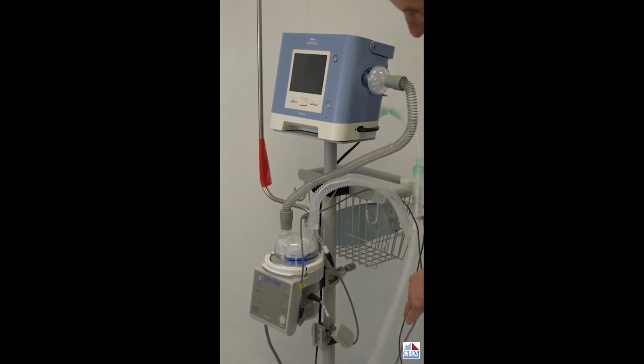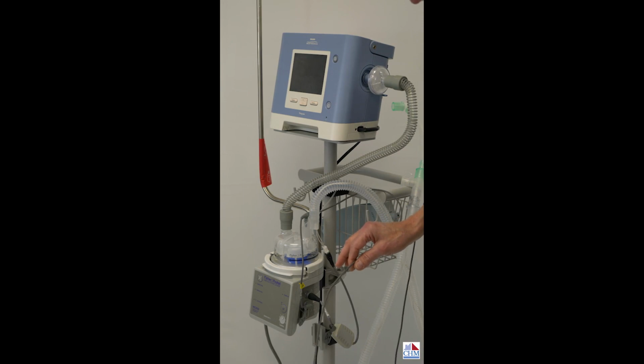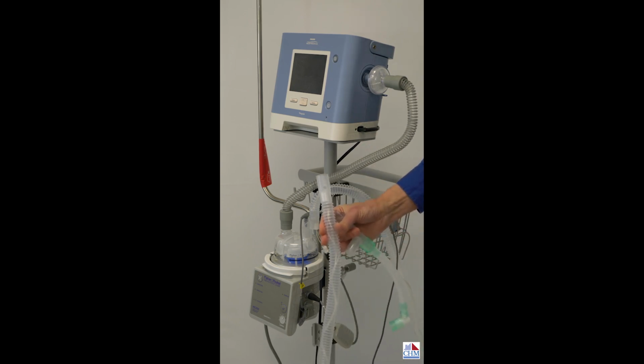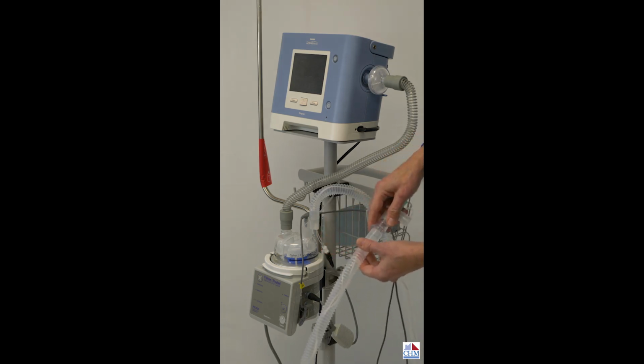And then if you follow this tube, you notice this tube is quite long, it's about 6 feet long, this wire is about 6 feet long, and it goes all the way up to a hole that is in the tube circuit. Now that hole is part of the circuit, so you notice when I take the whisper swivel off, that is part of it. The whisper swivel goes directly in here.